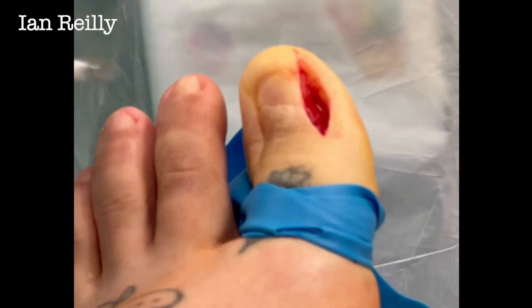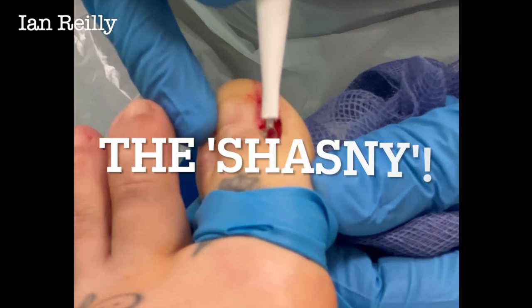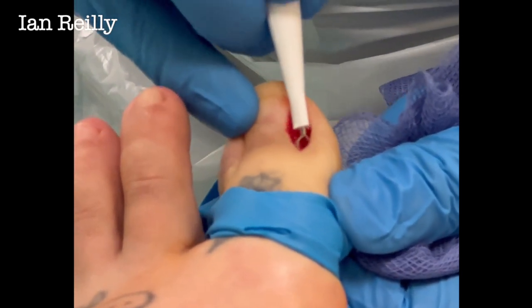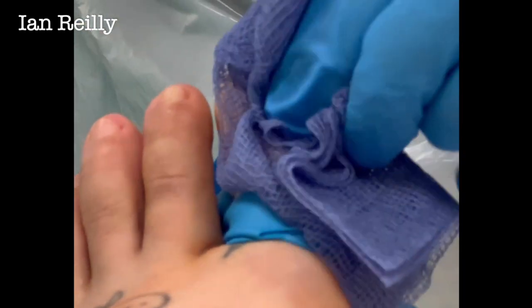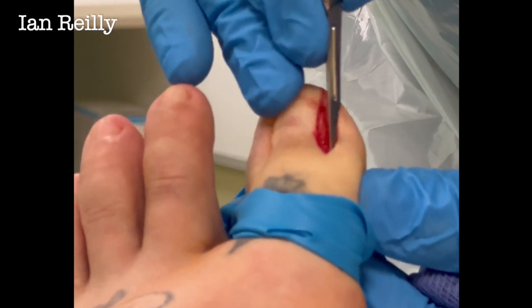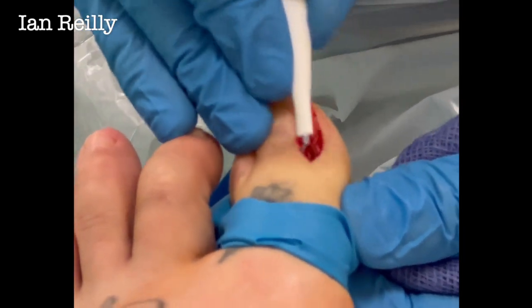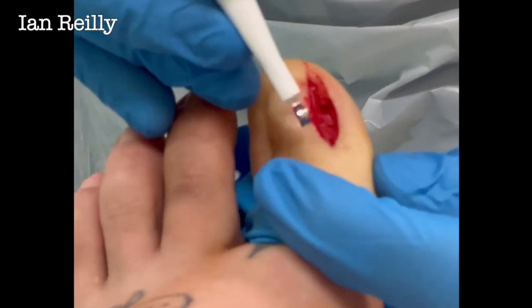Let's have a little scoop in there and see what we see. I've got a small loop curette — these Chasely ones are really sharp and these are what you want to use to get anything that is suspicious down on bone. I'm going to come back in with the 15 and inspect — yes, that is a little bit suspicious of nail. That's the bit we want to get out. I've done a couple of these — I've seen them like proper little icebergs in there. You just need to get all that tissue out; they can go an awfully long way medially.